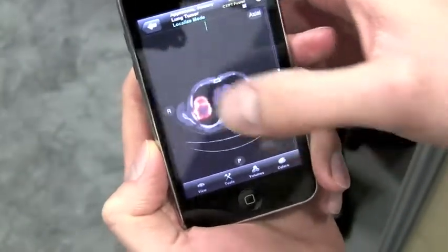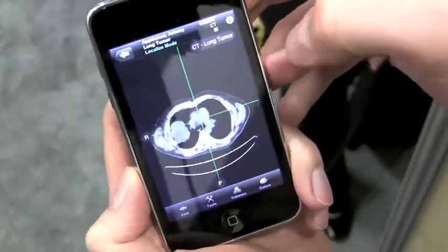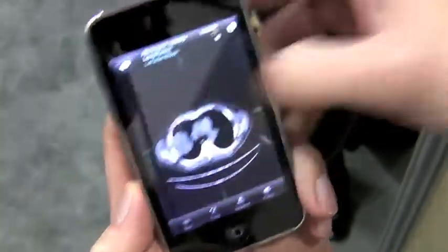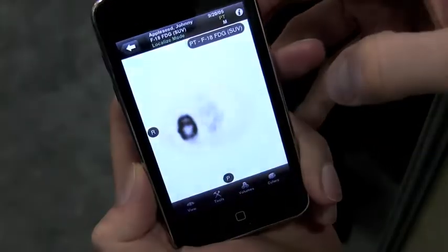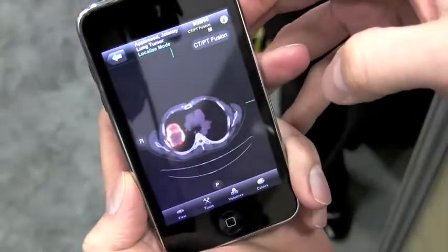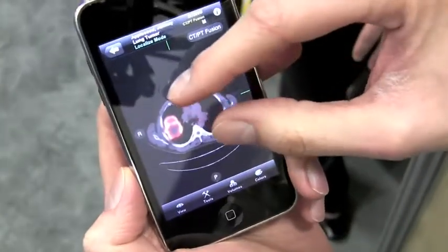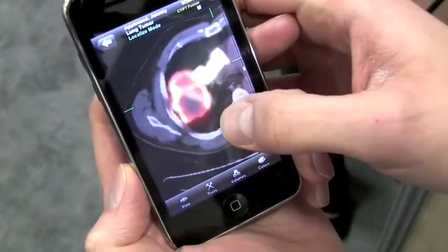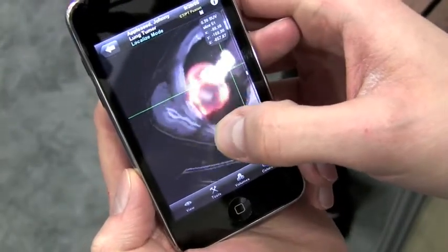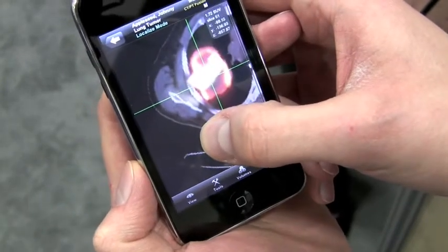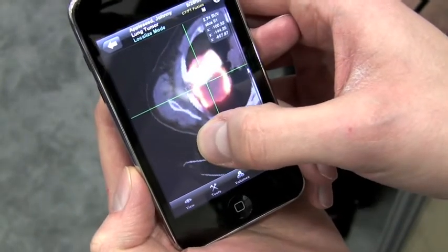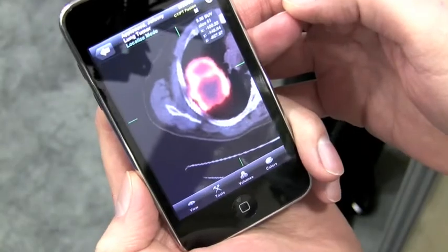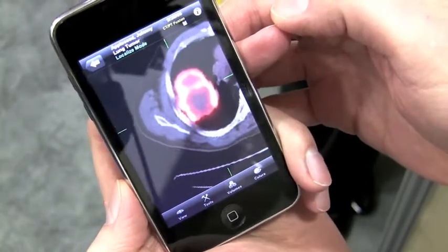We can go back to the axial. We can swipe left to right to change the image set — so this is just the CT, and this is just the PET, and we can go back to the fusion. We can pinch to zoom and pan around. We can localize to show the DICOM coordinates, and in this case the standard uptake value for diagnostic purposes.